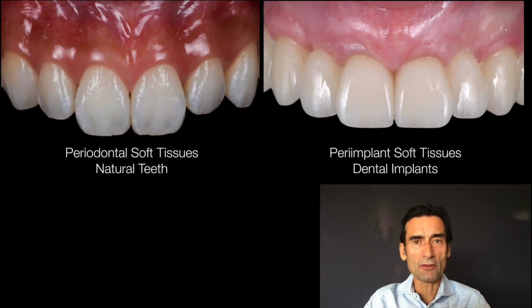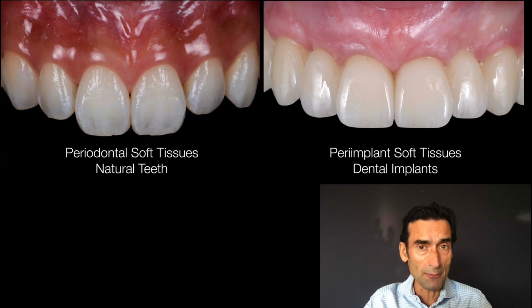So first of all, we need to realize that when we're looking at periodontal tissues around natural teeth and roots, like I'm describing here on the left side, this particular patient, as you can see, has beautiful gingival symmetry, has beautiful health, and has no gingival recession, just beautiful mucogingival tissues. But at the same time, you can see how thin the tissues actually are, how minimal the thickness is, and how pronounced the root contour of these roots are in the site. Now imagine that one or multiple of these teeth gets removed or gets lost. What will happen when we just place an implant?